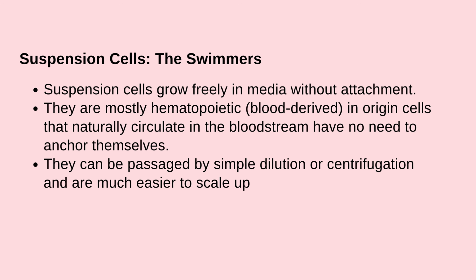Suspension cells. The swimmers. Suspension cells grow freely in media without attachment. They are mostly hematopoietic, blood-derived, in origin. Cells that naturally circulate in the bloodstream have no need to anchor themselves. They can be passaged by simple dilution or centrifugation and are much easier to scale up.